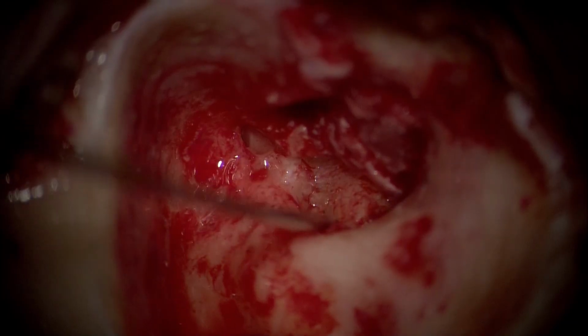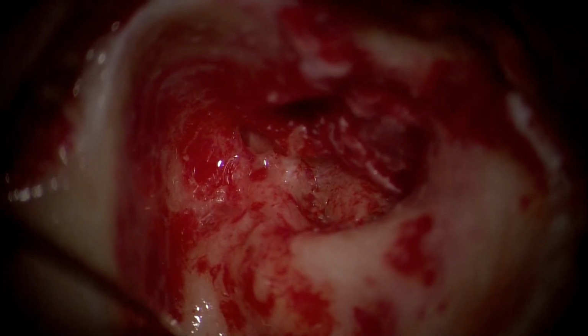We see how we are still lowering and thinning the facial nerve, sometimes right to the level of the actual sheath of the facial nerve, because we have to clean the disease no matter what. We cannot leave disease behind. And now you start seeing the tympanic segment of the facial nerve once this epithelium, this cholesteatoma, has been completely removed. We have also removed the remnant of the stapes, because there was no actual head, just some remnant of the capitulum inside the epithelial sac. Now what you see is an intact tympanic segment that transitions into the vertical segment, the absence of the stapes head, and only a footplate region.